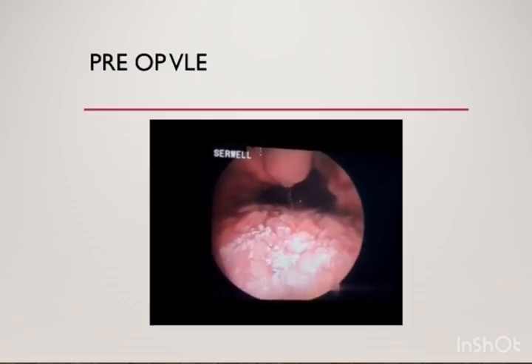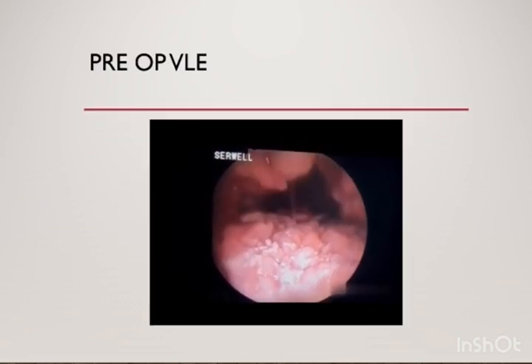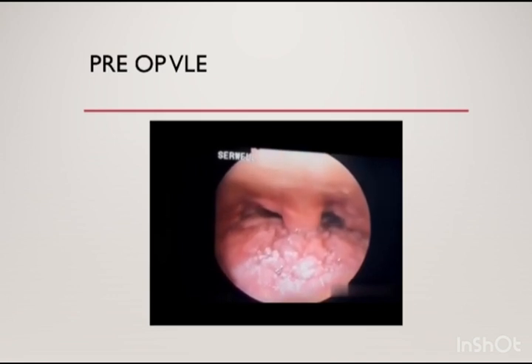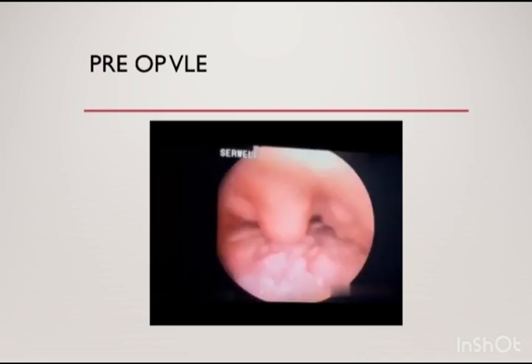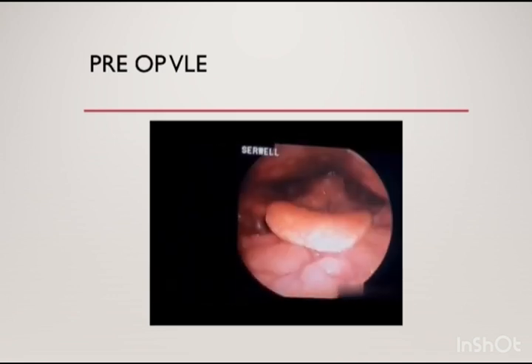This is a pre-operative video laryngoscopy, which shows the tongue and base of the tongue. The posterior tongue is bulky.